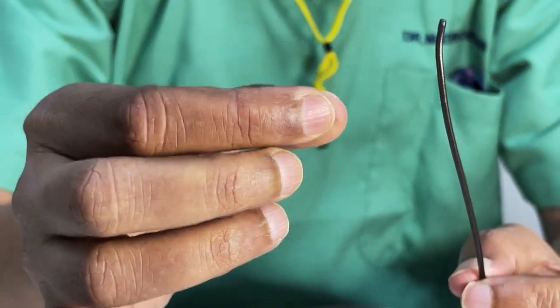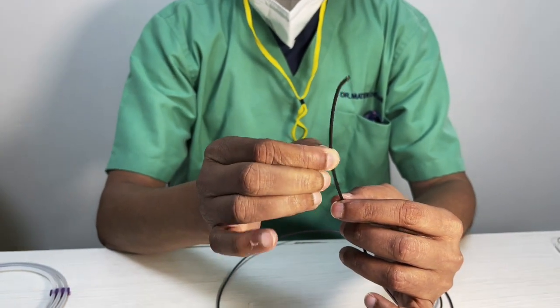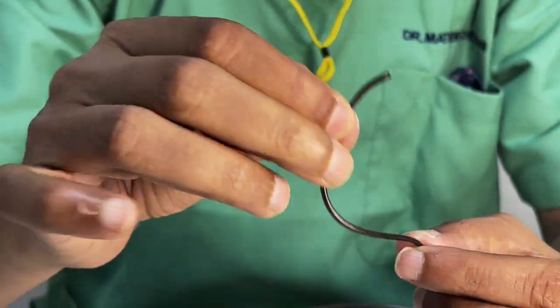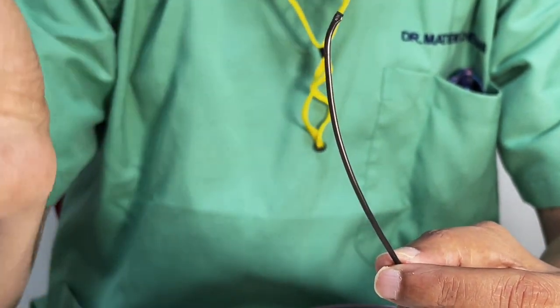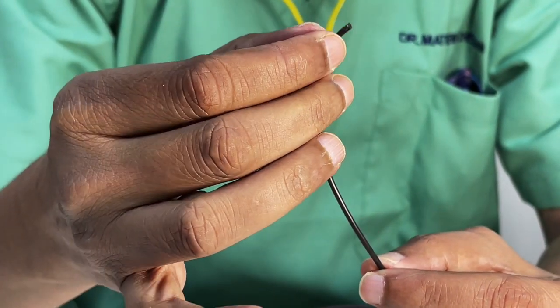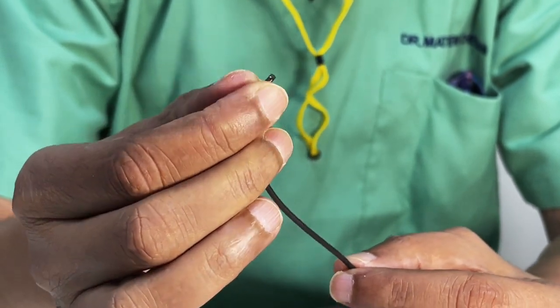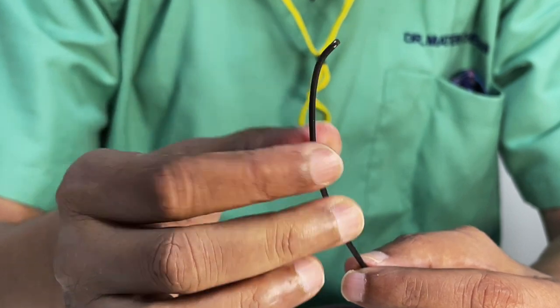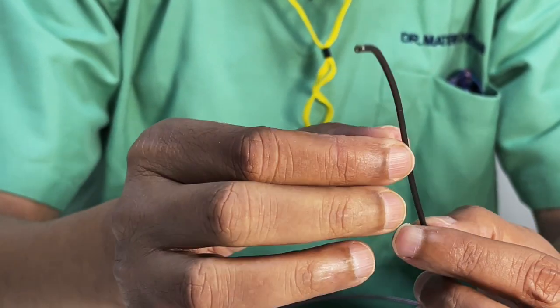See this. I'm pressing this. Can you see that? It's bouncing back. Can you see? I do this and it comes back. Now tell me, what would you choose? Would you like to use this catheter? Except for exactly the final tip, which has no braiding, everywhere else I do this and it bounces back. See, whatever I do, I can't.